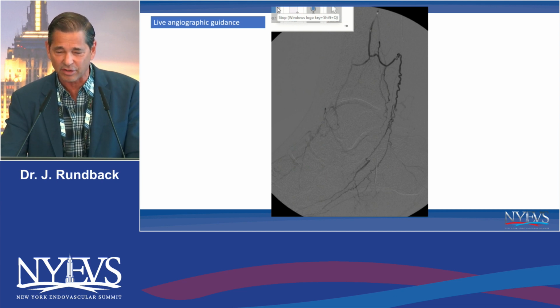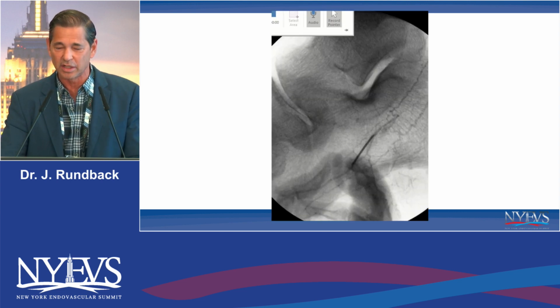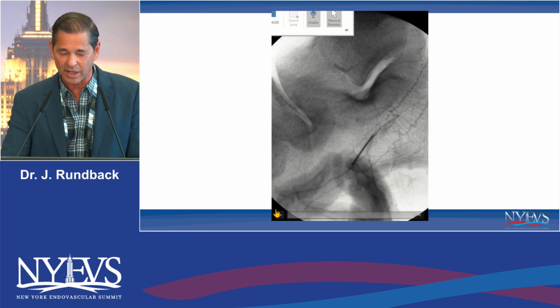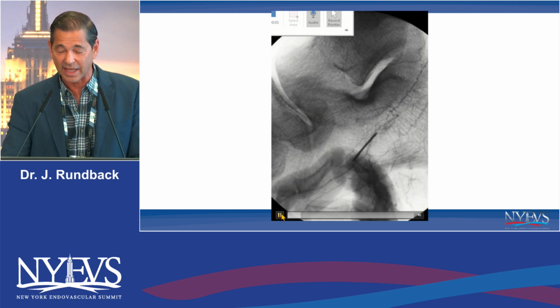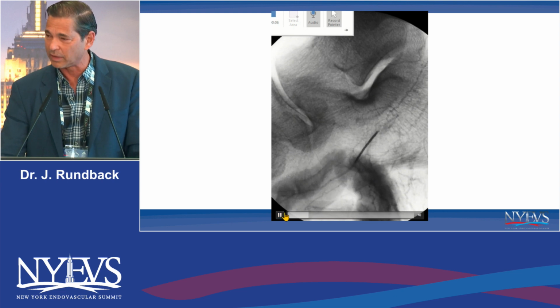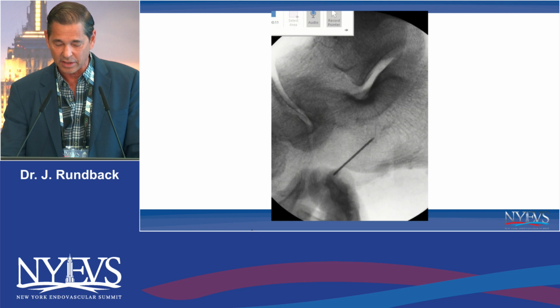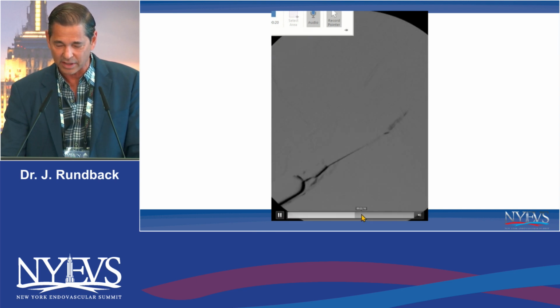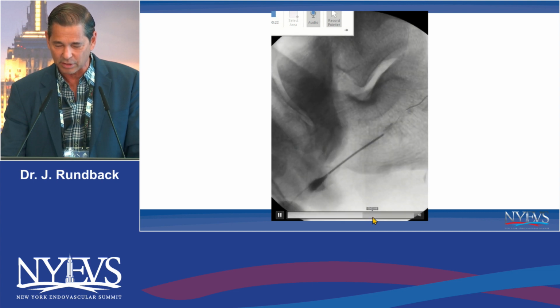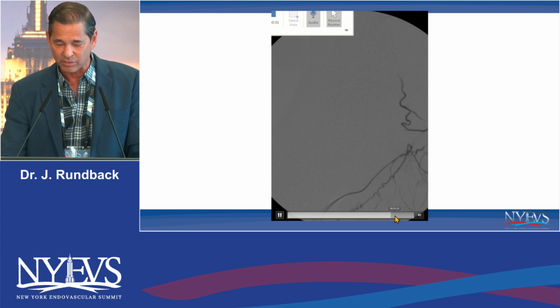We put the microcatheter in the peroneal, so that was the best collateral to reconstitute the vessel we wanted. In real time, while puffing, we could see the artery and land on the artery. It's like landing a plane, right in the best view. Generally, you'll see the artery yield. There, that was a little bit out, and then we go. We're a little bit deep, so we pull back and get the wire to advance, and confirm that we're in after exchanging with a 3 French introducer.